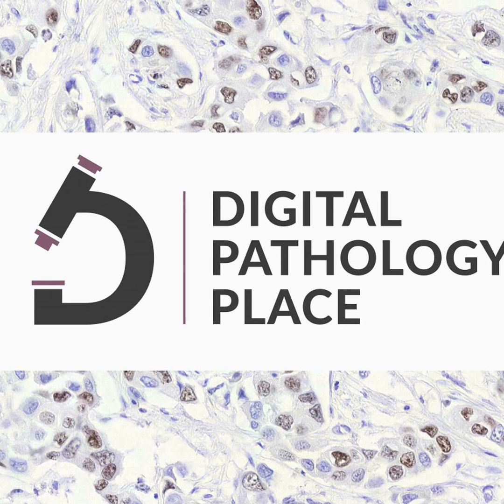And we already saw in this other paper, multimodal is a lot better than unimodal. And they developed and evaluated an autonomous clinical artificial intelligence agent leveraging GPT-4. So we're talking about the generalized pre-trained transformer, our ChatGPT friend, with multimodal precision oncology tools to support personalized clinical decision making. And this system incorporates vision transformers for detecting microsatellite instability and KRAS and BRAF mutations from histopathology slides.